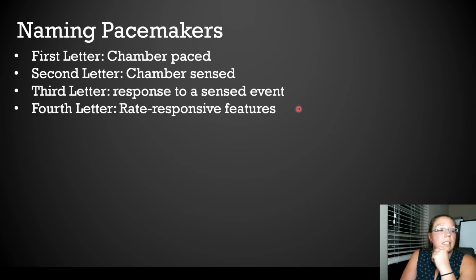The fourth letter tells us rate responsive features. And this is what is very, very cool about pacemakers, is that we are now at a point in medicine, which it's been around for a little bit, but it can pick up on physiological and non-physiological signs and then increase the heart rate. So let's say you have a pacemaker, it's set to go off at 70 beats per minute or 65 beats per minute, but you decide, you know what, I'm gonna go take a walk with my family. In a normal human being without a pacemaker, your heart rate's gonna naturally go up. Well, if your heart is sick or damaged in a way where you're not going to get that heart rhythm and you need a pacemaker to set that rate for your heart, your pacemaker has to respond as well.